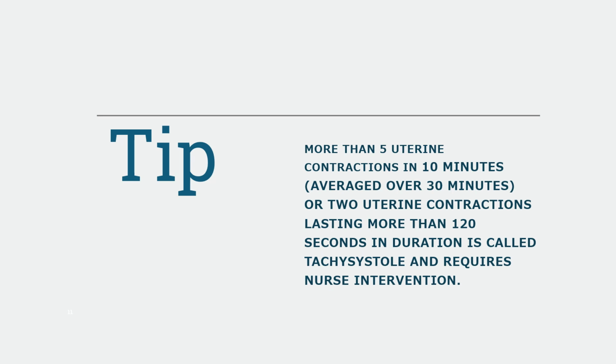You want those contractions spaced out, okay? Not too far spaced out, but you want them spaced out enough that they have a good labor pattern, but they're not contracting too frequently. And if they are, you need to back off on the Pitocin. You either need to turn it off or you need to turn it down, okay? Nurses have the liberty to do this on labor and delivery. You run the Pitocin. The provider writes the order, you control it. So based on what you're interpreting. Okay, so I just wanted to make that note.